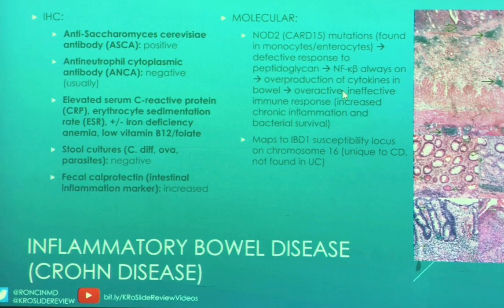Like you have millions of these lymphocytes and plasma cells and eosinophils and everything else that's in your lamina propria, but they're kind of just focused on all the cytokines that are there, that are calling them there, rather than looking at, oh, the bacteria that's here, and we have a job to do.